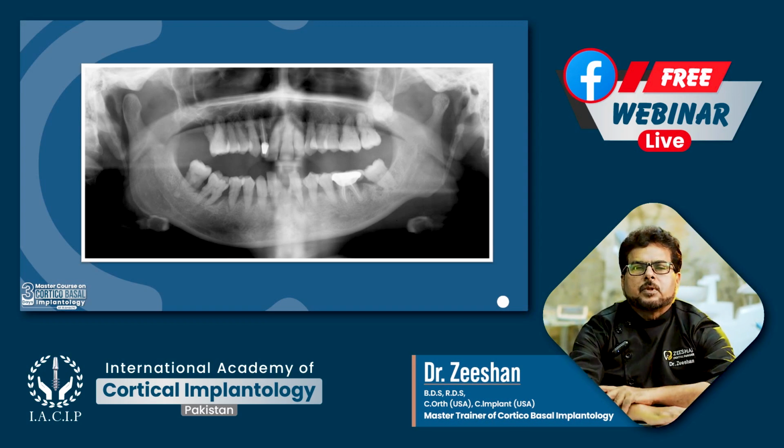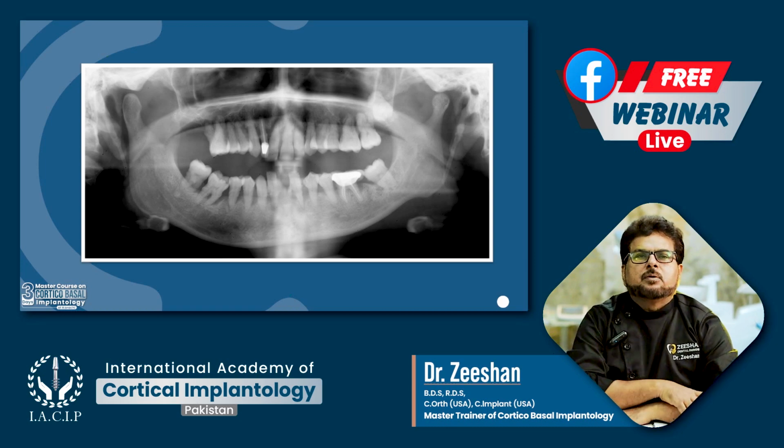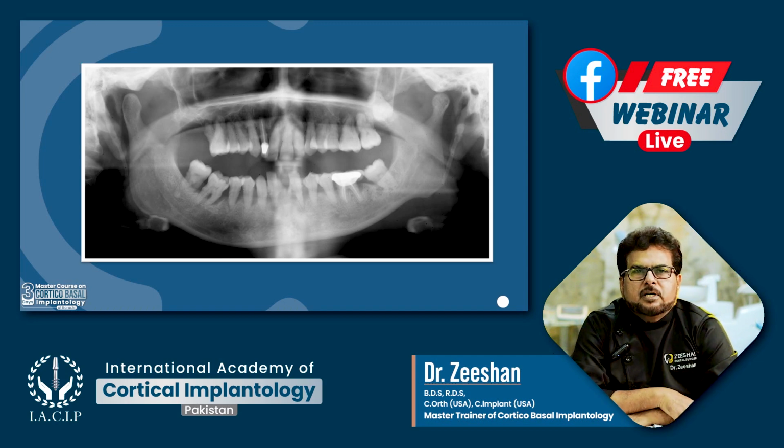Patient wants teeth. So in such cases, we have to extract all the teeth and choose the areas which we have to learn which areas are supposed to be strategic for placing the basal implants, and then we can load them immediately. Definitely we have to load them with temporary teeth for the period of shrinkage of the extraction sockets. That has to happen, and then after shrinkage you can load them with the permanent prosthesis. So immediately you need to place implant and then splint them, then load them.